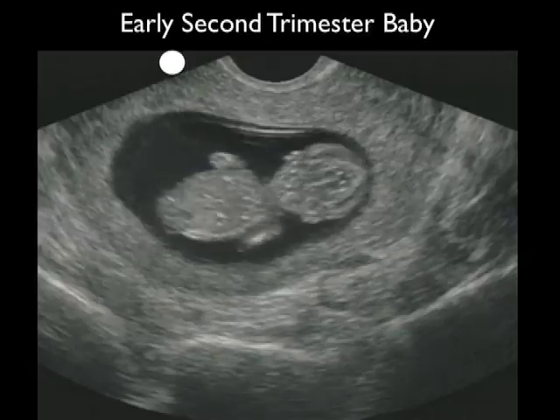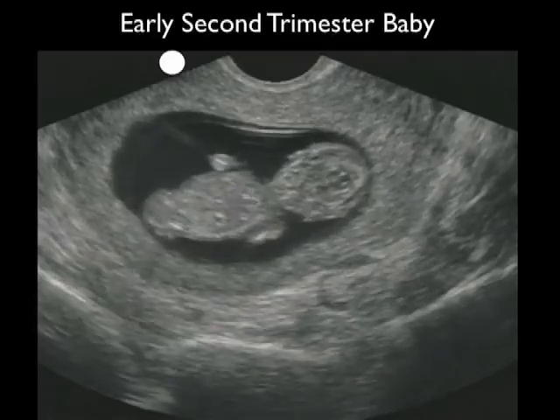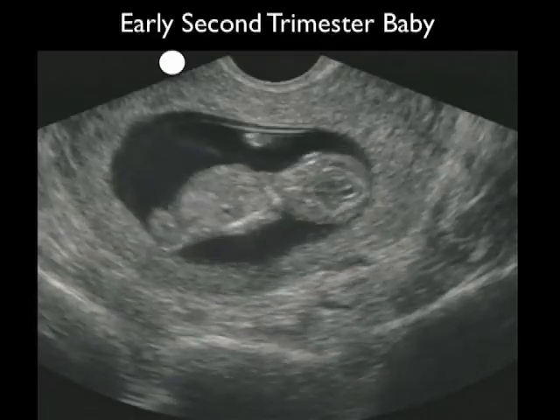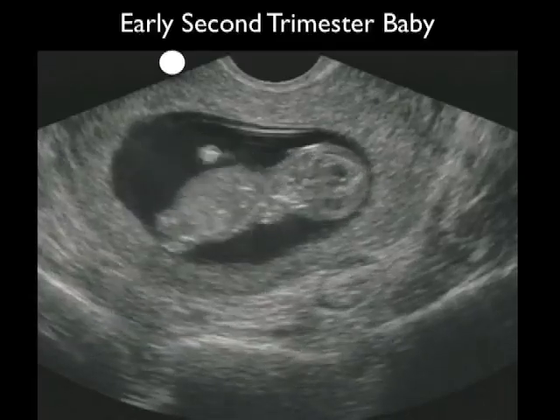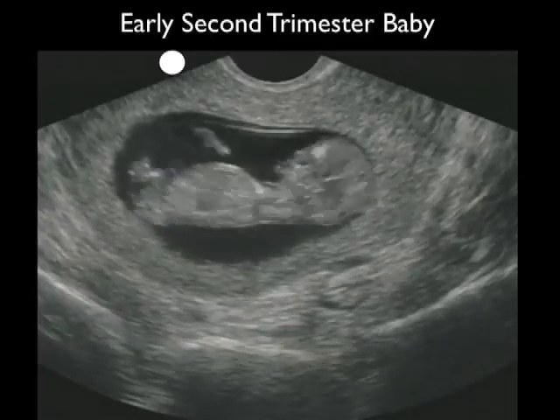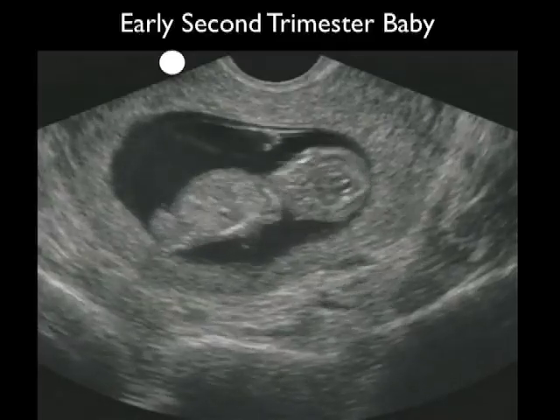Here's another second trimester baby. Working in northern Manhattan, I refer to this as the merengue baby. Note the baby moving around fluidly within the amniotic sac — a sure sign that this kid will grow up to be a slick dancer.